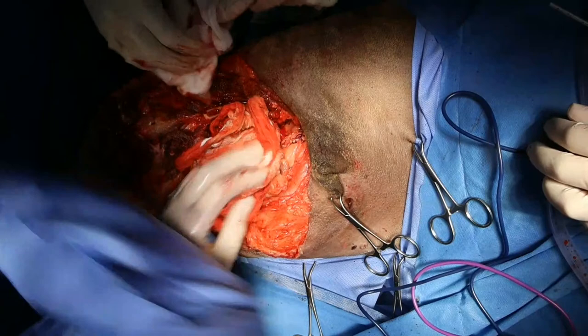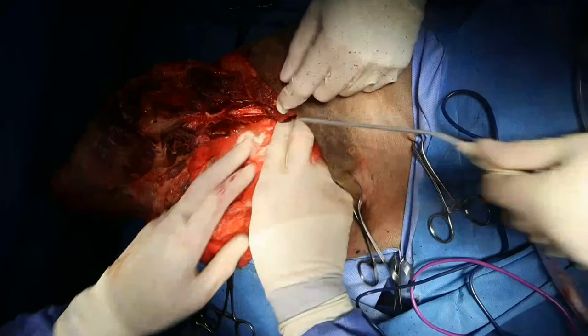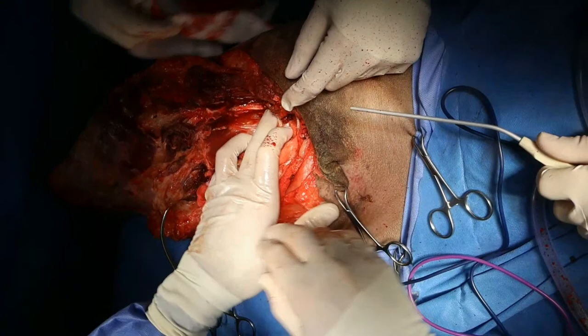A little bit of bleeding here, I think just from the... Yeah, now we've transected our sciatic nerve already, which is fine, but you see how easy it would be to do that during a double pelvic osteotomy?